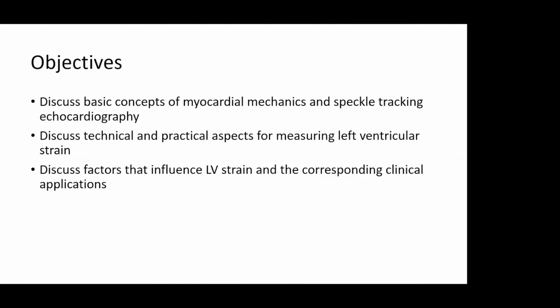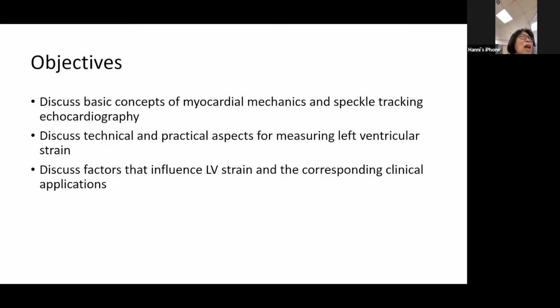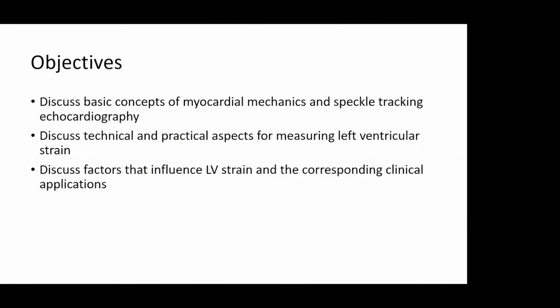So my objectives are threefold. The first is to discuss some basic concepts of myocardial mechanics, which we can't really talk about strain without talking about mechanics, and the basics of speckle tracking echocardiography and what the essential concepts of that are.